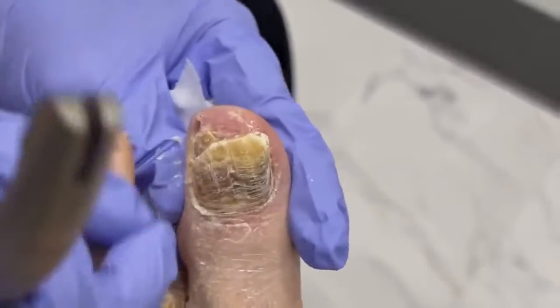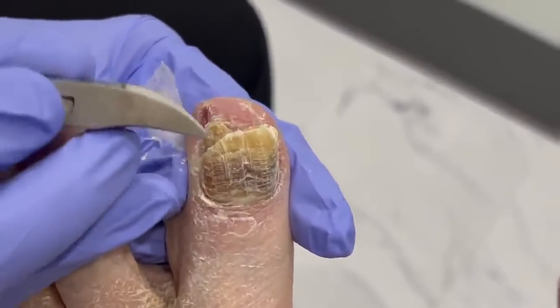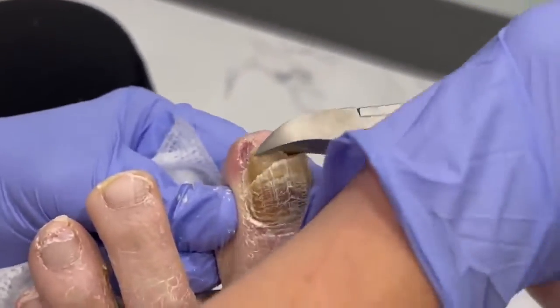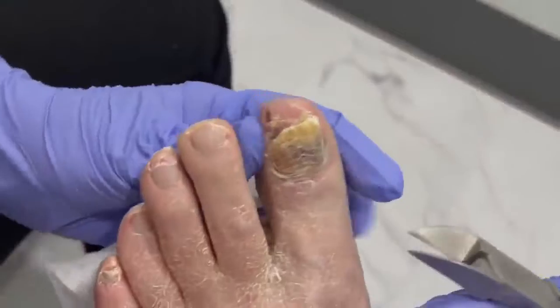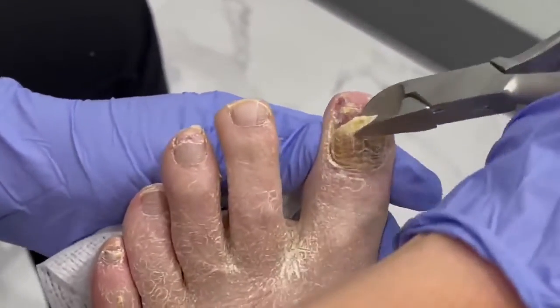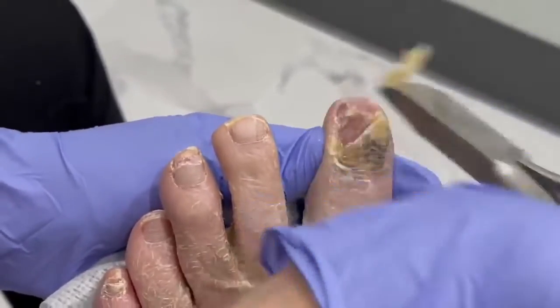There we go. Are you ticklish? Look at that. Let's see if I can pull that little piece out — whoa, oh my gosh, look! It's almost like you had another nail growing under there, and it was really just pretty much skin cells. Geez, oh, this is a good one.